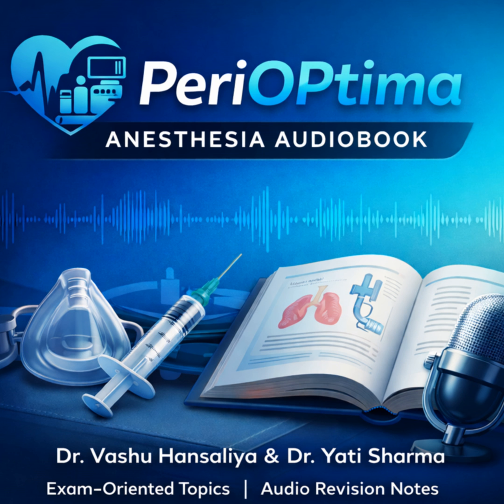And the final principle you have to mention is artifacts. Every monitor lies eventually. Right. A damped arterial line underestimates systolic pressure. Diathermy messes up your ECG. Your job is to be the filter. Clinical correlation is king. If the monitor shows asystole but the patient is asking you for a sandwich, check the leads. Don't start CPR. Please don't start chest compressions on the talking patient. That would be an automatic fail and probably a lawsuit.